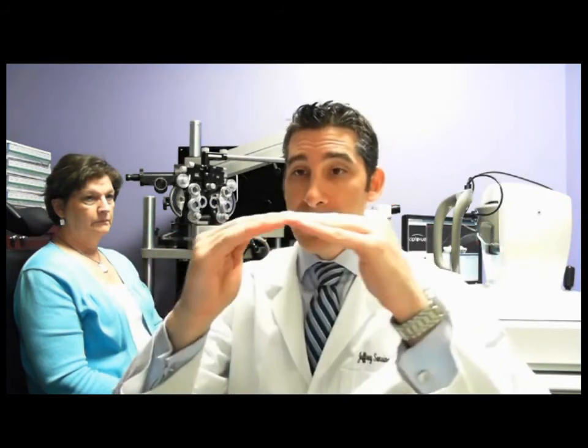So judging by the fits of both of these lenses on both slit lamp inspection and OCT inspection, my plan for Darlene is I want to add more reverse geometry curve to that right one to get it to, instead of sitting on the cornea at the periphery, sit off of the cornea. I want the optic zone to be broader and flatter, so that it sits off of the nodules and instead lands more peripherally onto the eye. So we're going to add 2 diopters of reverse curve. We're also going to increase the optic zone diameter in that right eye. By increasing the optic zone diameter, we bring it off of the nodules. And we're going to change the power based on our over-refraction.